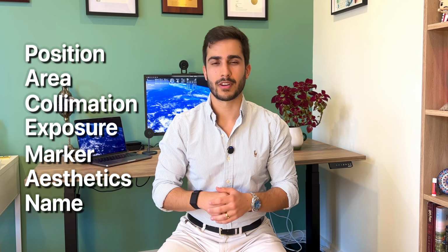Positioning really refers to whether the patient is in the correct position. Are they rotated? Are they tilting left or right? Are they leaning back and forth too much? Does the image correctly show the needed joint spaces? That kind of thing. Area refers to whether there's enough of the anatomical region of interest that's been covered. Has there been anything cut off? Or has there been any area exposed that didn't really need to be? Really addressing whether or not the relevant bones and organs of interest are being obscured in any way.